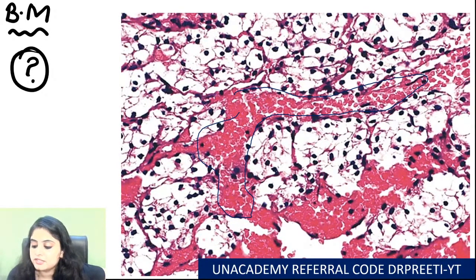Okay, Dr. Pankaj says, no, every bone marrow that we see will not be CML. Don't think that I've shown you bone marrow, it has to be some hematological problem only. Anyway, if it would have been CML, what would you have seen? You would have seen garden party appearance. You would have seen lots of myeloid lineage cells.